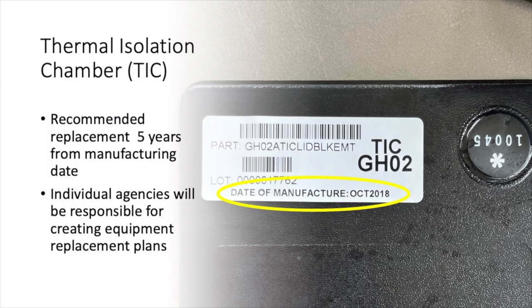Prior to each use, your TIC should be inspected as well. To inspect the TIC, all you're going to do is look at all of the seams, both on the container body and the lid, and what you're looking for are any cracks that may allow leakage of the PCM from the container. Also pay note to the manufacturing date, which is found on the barcode on the underside of the lid. It is the manufacturer's recommendation that TICs are replaced 5 years after the date of manufacture.